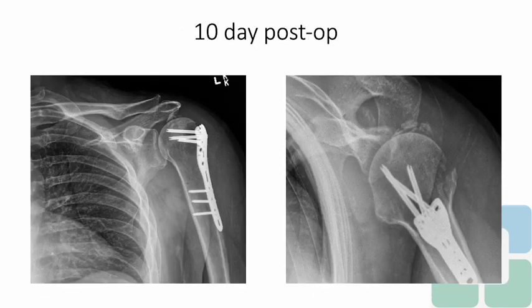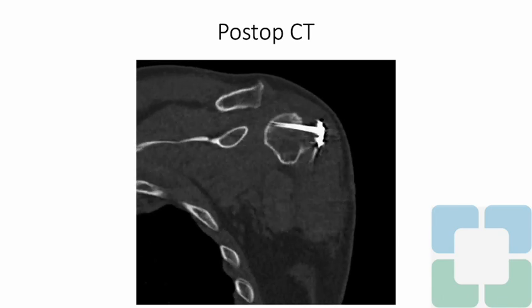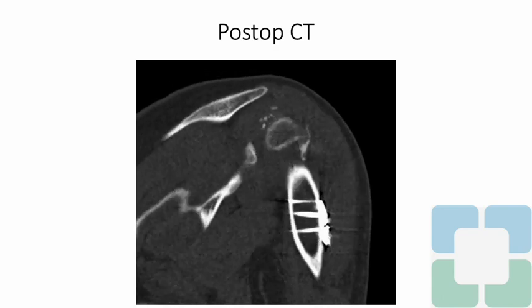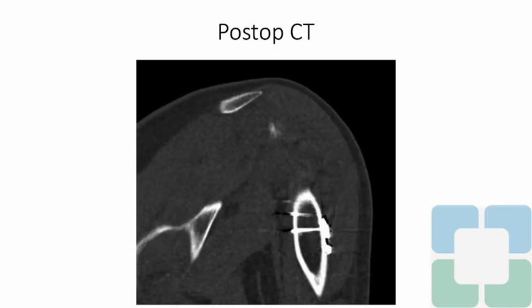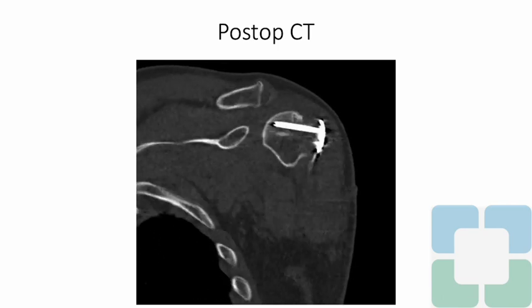Unfortunately, at his 10-day postoperative visit, there was redisplacement of the greater tuberosity fragment. Postoperative CT scan is shown here, coronal slices, which demonstrate redisplacement of the greater tuberosity fragment with posterior comminution. We discussed these findings with the patient, and he elected to proceed with revision surgery.